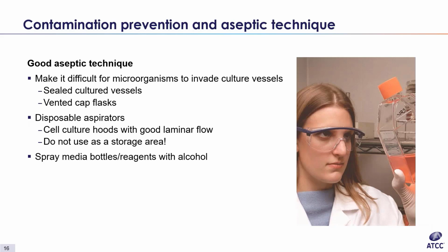So what can you do to make sure cells and culture do not get contaminated? I'm going to point out a few tips that should prevent contamination problems. First, in general, you want to make it hard for contaminants to enter your cell culture vessels. Small dishes, such as 35 to 60 millimeter dishes, can be placed in larger ones when in the incubator. Placing plates and dishes in larger ones is also ideal for transport. This adds an additional physical barrier that prevents particulates from entering. When using flasks, it is recommended to use vented caps that can be sealed tightly, but still allow gas exchange.